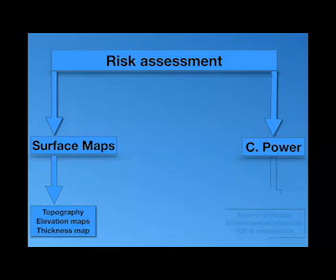And the corneal power is related to the error of refraction, the biomechanical properties, intraocular pressure, and associations related to the corneal tissue itself. If there is a scar, if there is thinning, if there is a post-trachomatous pannus, if there is corneal vascularization, the old tissue changes. The histology of the cornea may affect the corneal power and at the same time affect the images of the surface maps too.